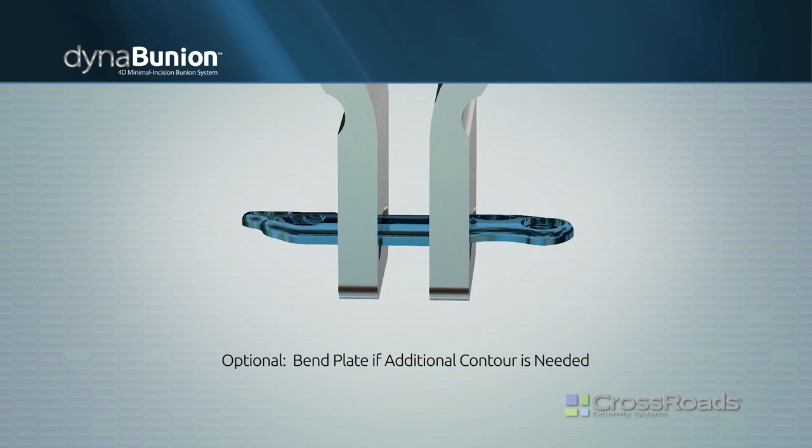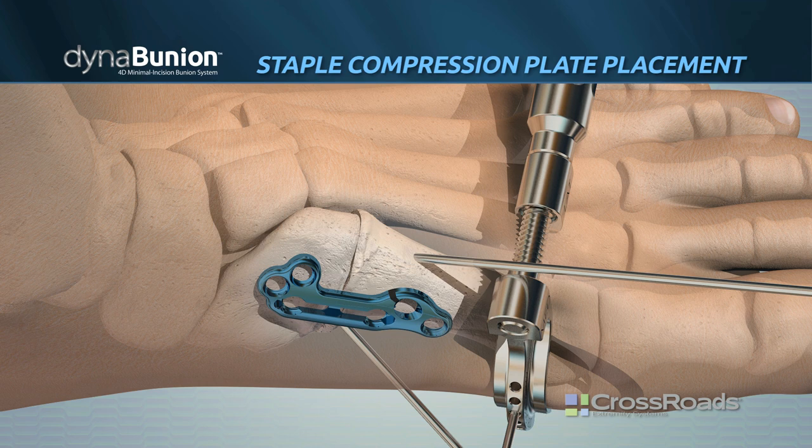Align the plate by centering the staple slot over the joint and positioning the plate in a direct medial location. Place one olive wire into the most distal hole and one olive wire into the most proximal hole.